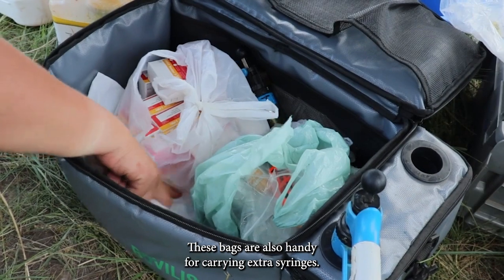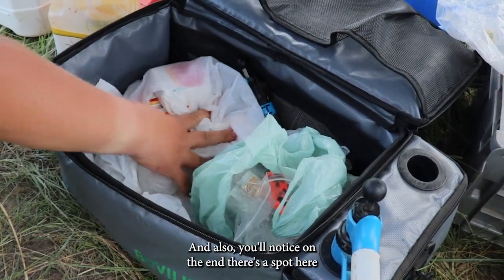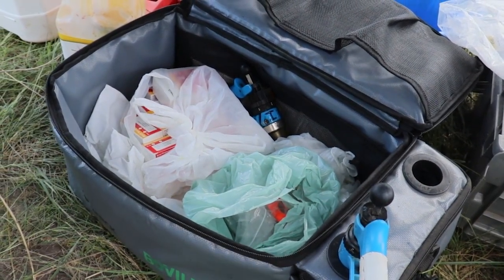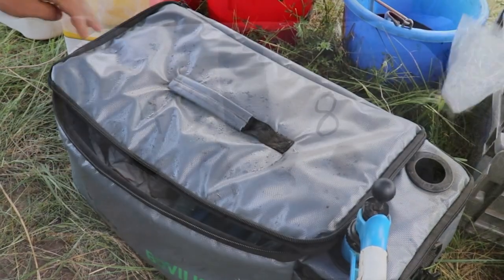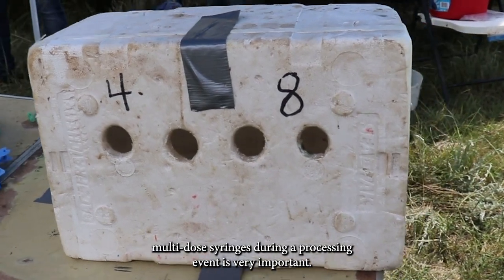These bags are also handy for carrying extra syringes, and you'll notice there's a spot for maintaining syringes in between animals. You're able to put ice packs in between these two tubular holders. Having a place to store your multi-dose syringes during a processing event is very important.